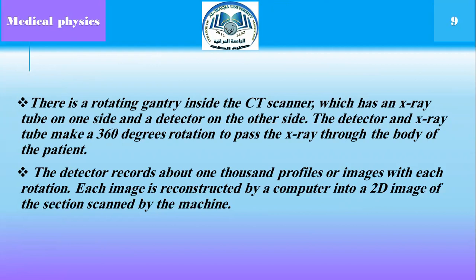The detector records about 1,000 profiles or images with each rotation. Each image is reconstructed by a computer into a two-dimensional image of the section scanned by the machine.